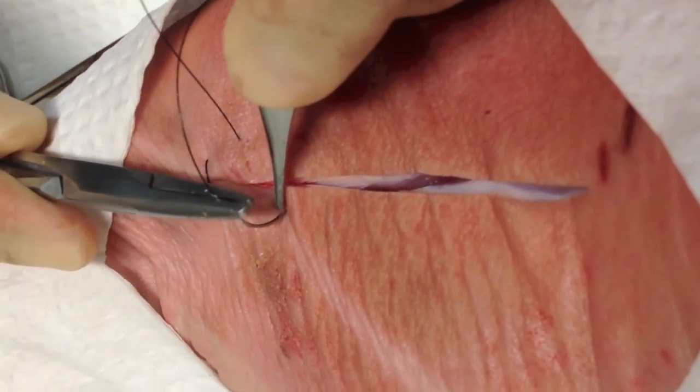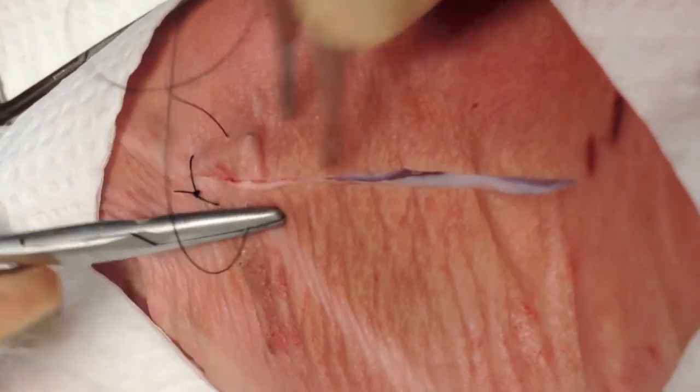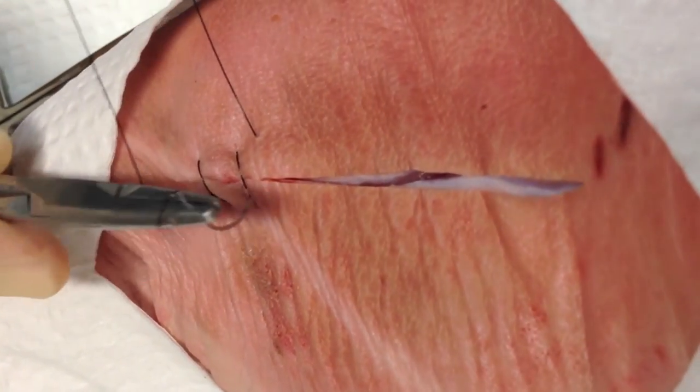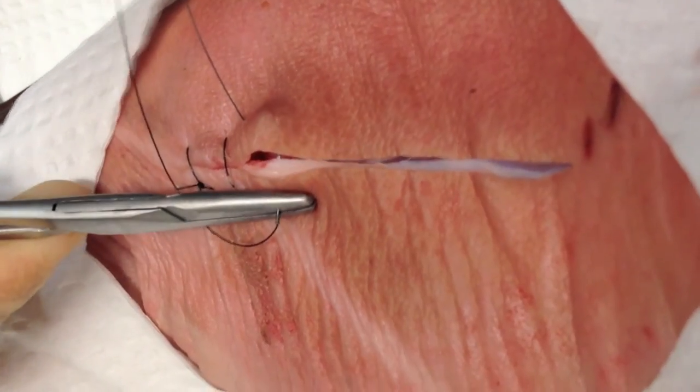The nice thing about this suture is it has the ability to adapt to progressive swelling of the wound. It is, however, a little bit difficult to control the distribution of tension across the wound, so you don't really want to use this for irregular wounds.